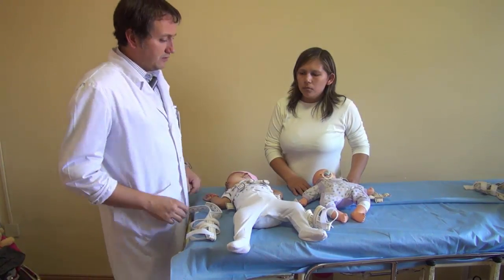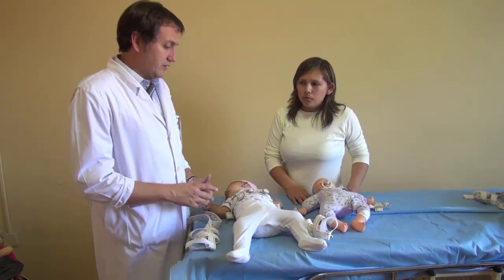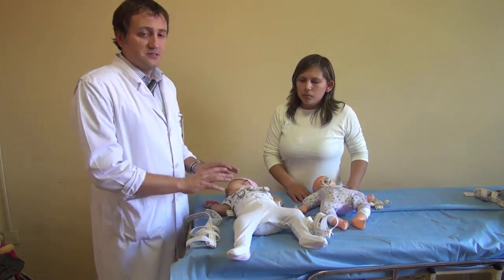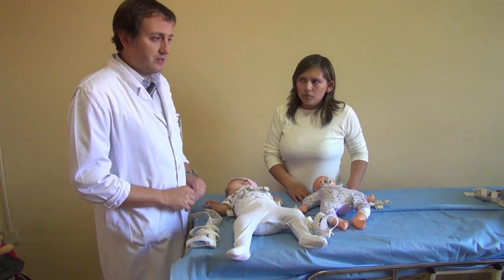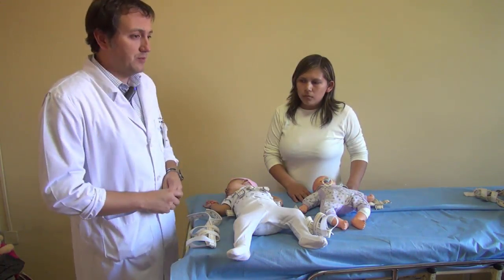Now we spoke with the mother about the pavlik harness and now we're going to put it on the baby. Since the real baby is sleeping right now, we're going to do the first part, the upper part, in the baby model.